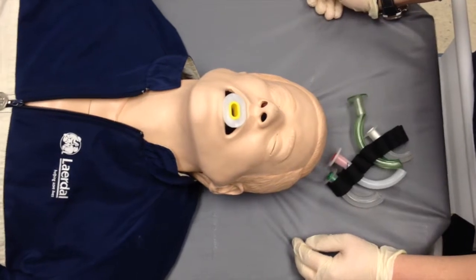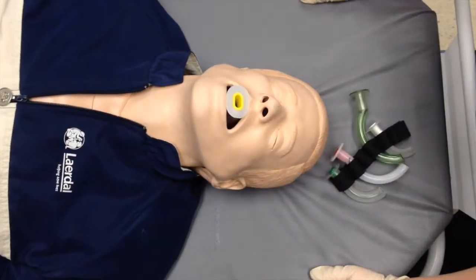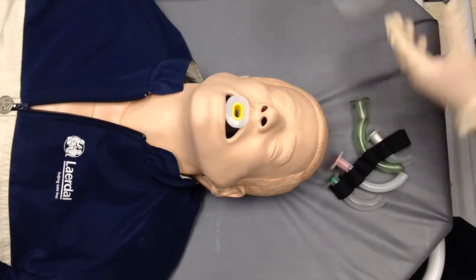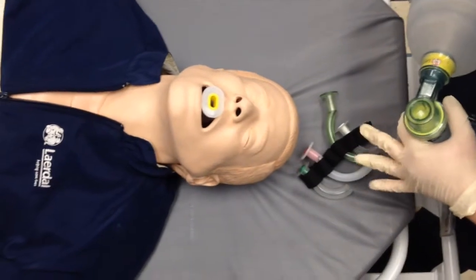Possible consequences of selecting an oropharyngeal airway that is too short: the airway may remain obstructed. Consequences of selecting one that is too long: it may occlude the airway, may damage structures of the upper airway, and may protrude from the mouth, complicating use of a bag-valve mask.